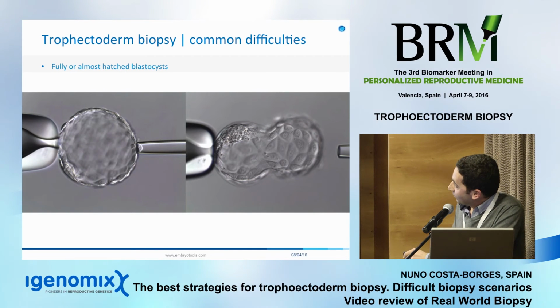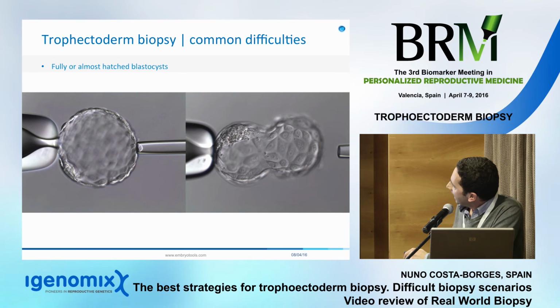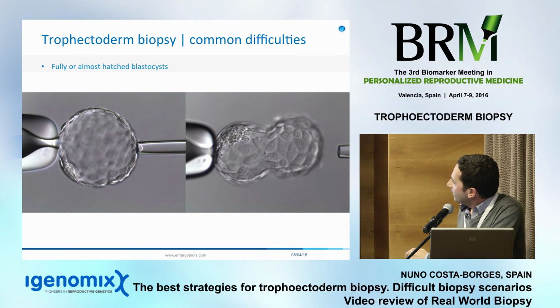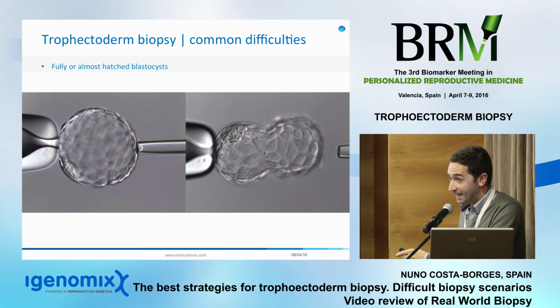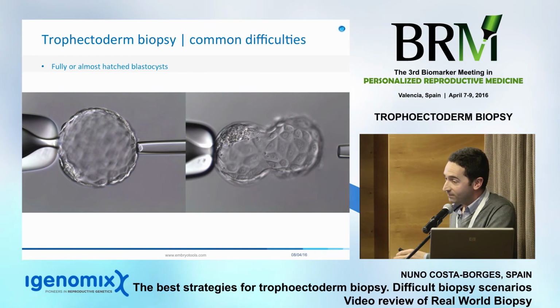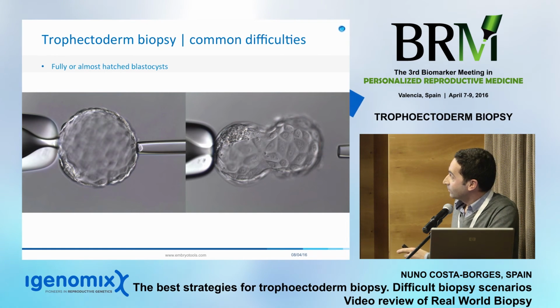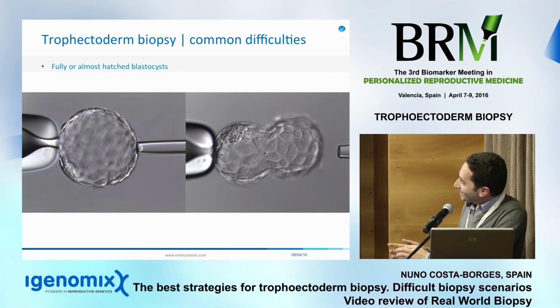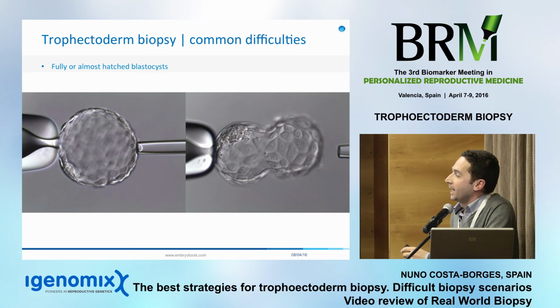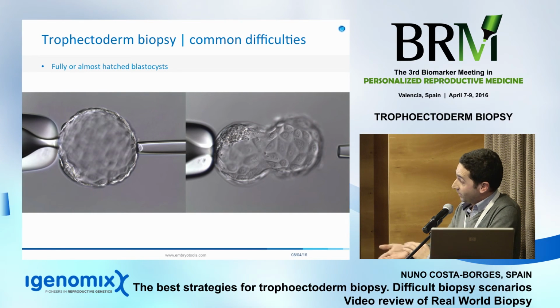And this flicking method is for these big guys. Many people ask us, oh, but these blastocysts are completely hatched or almost hatched, and maybe during the biopsy they will come out of the zona. But we have to say that we have very good results also with a completely hatched blastocyst. They implant very well. We can freeze them very well. Actually, if we freeze them immediately after the biopsy when they're still collapsed, we have very good results. I think, if Anna allows me to say, for the completely hatched blastocyst, the only thing different that we normally do, and maybe you can confirm if it's correct or not, is that when we vitrify them, we leave a little bit more medium so they don't get stuck to the leaf of the cryotop.